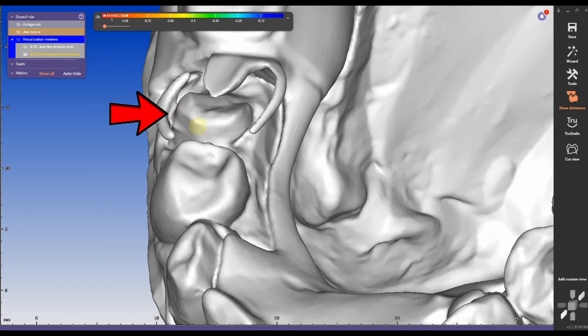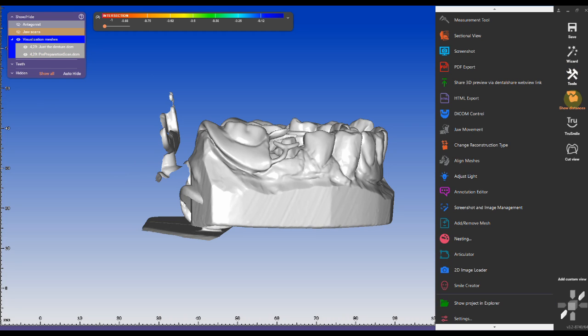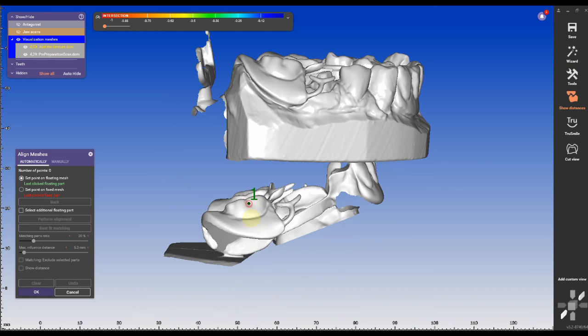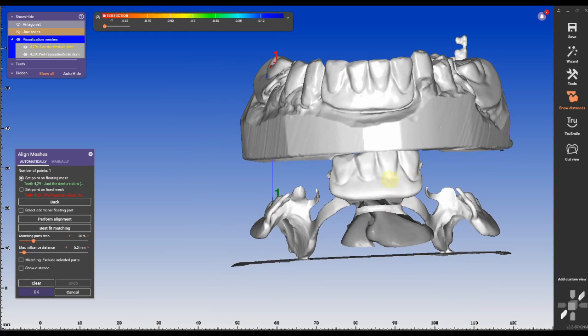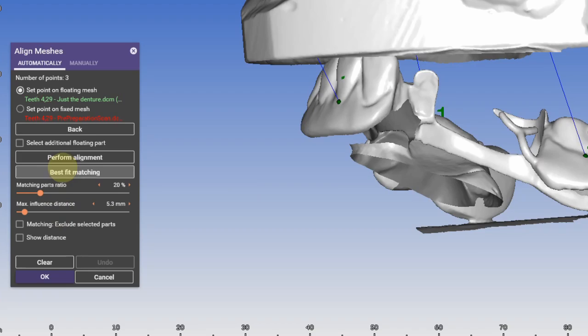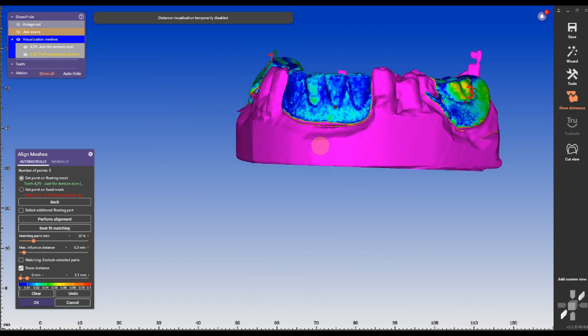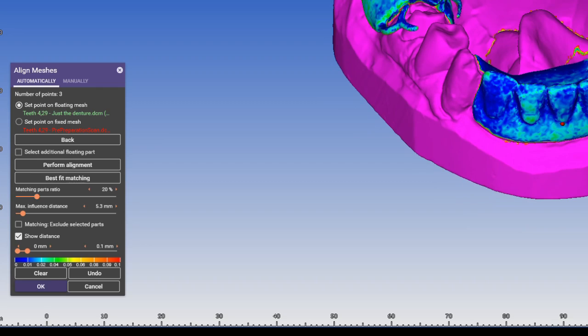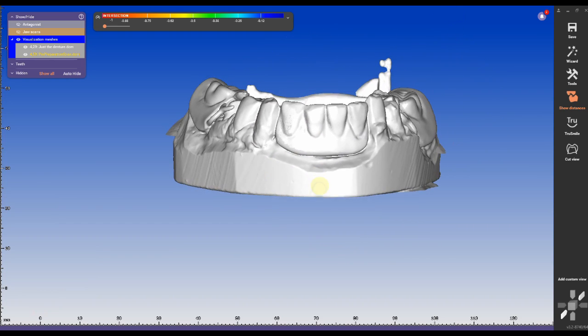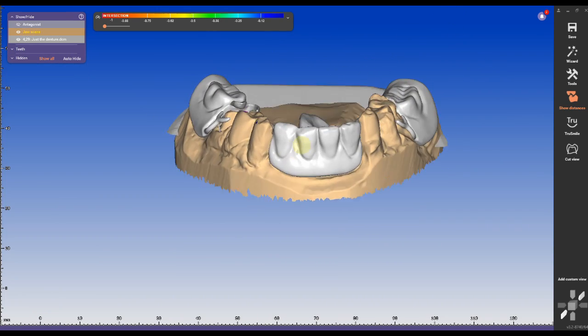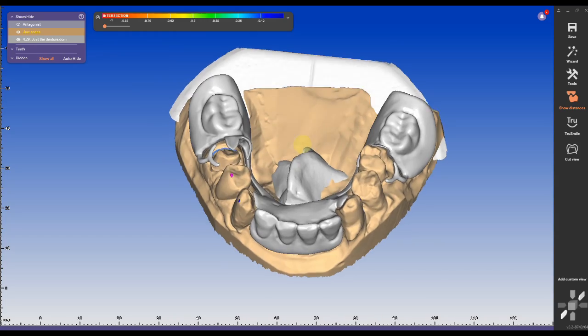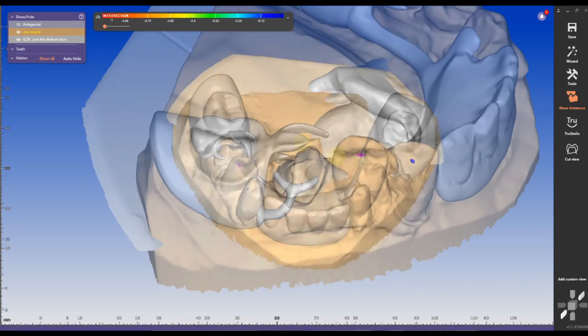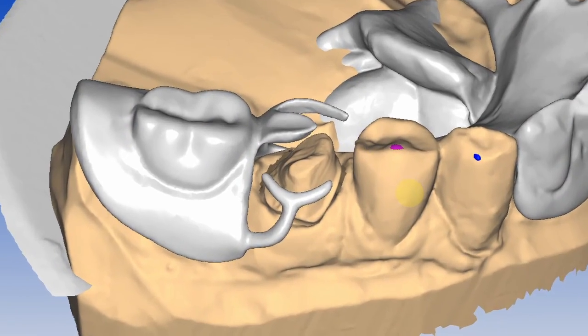Therefore we have to align the partial scan to the preparation scan. That is usually very easy because we have a lot of reference points and it shouldn't be very difficult. Once the alignment is complete, click OK and what we get as a result is a clean scan of the partial, especially the clasp onto the preparation scan.